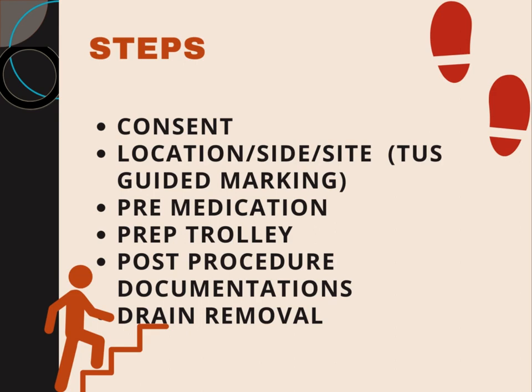Then an important thing is post-procedure documentation, so I always emphasize what you have done. Probably the patient is moving to the surgical department or some other departments, so they are not very well aware of how to care for them in the ward. So documentation is very important. I'll bring up the thought in one slide, on what ideally should be in terms of observations or other documentation for that.